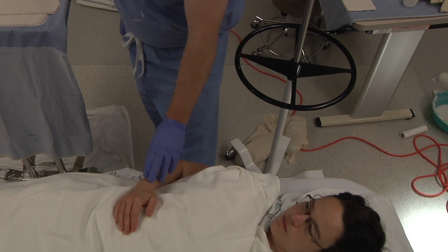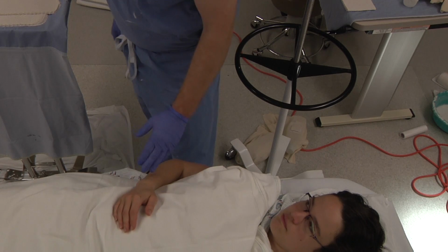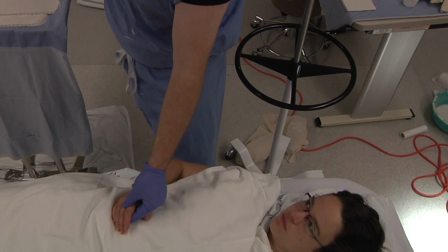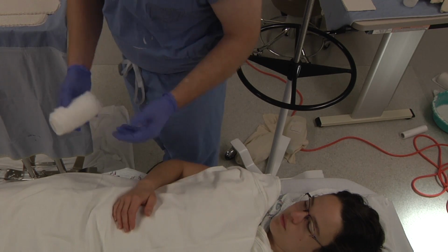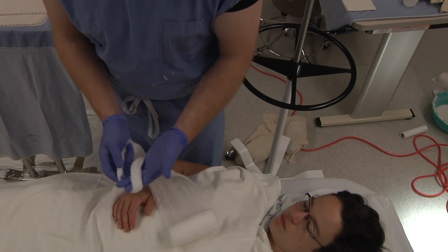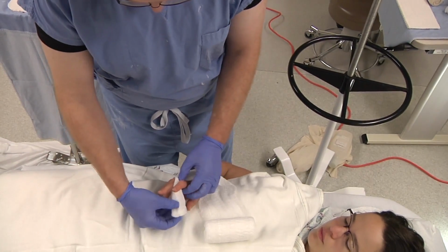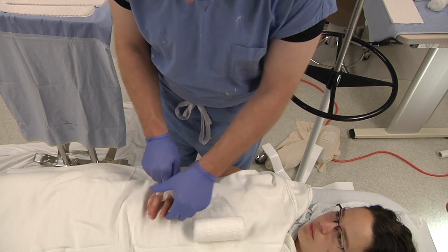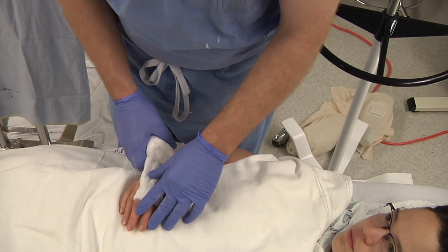Next, generally, we want some traction on the fracture site to keep it from compressing and utilizing ligamentotaxis. So if you have finger traps easily available, those can be used and suspended from an IV pole. Another way to do it is simply with a Curlex roll. Simply make a loop, bring it down around the patient's fingers, and pull. It'll be tight. This is somewhat constrictive, so you do need to be cognizant of that.